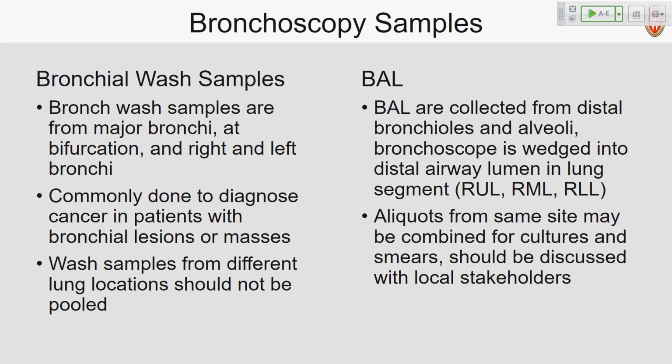And one other thing worth calling out: wash samples. If you're getting a bronchial wash sample, that is actually indicated to not be pooled. I know there is some conversation about some specimens that we do talk about potentially pooling together through the microculture process, but bronchial wash samples are actually recommended not to be pooled from different lung locations.